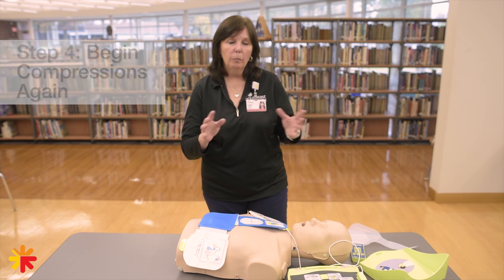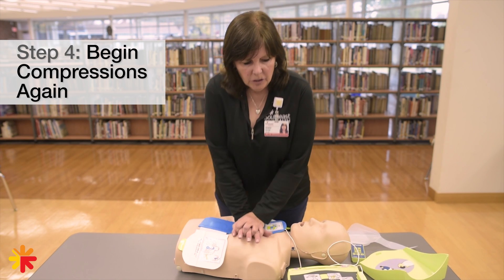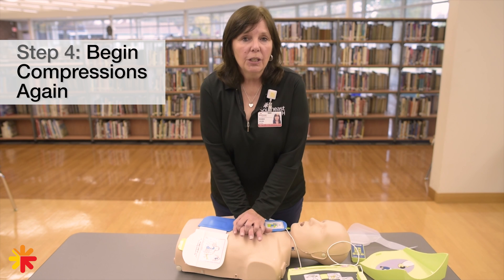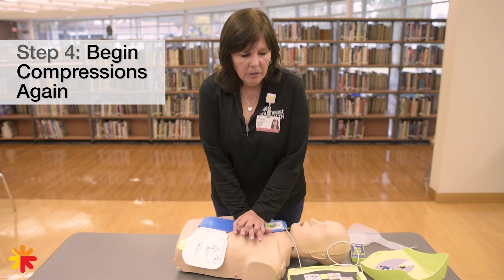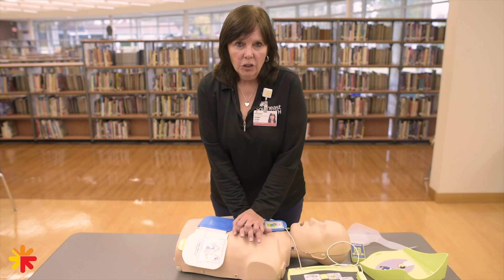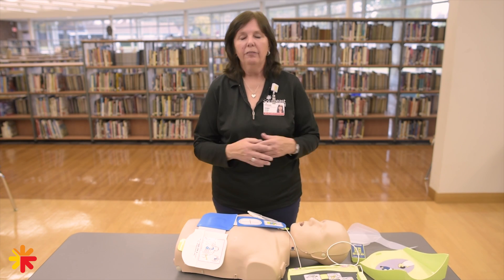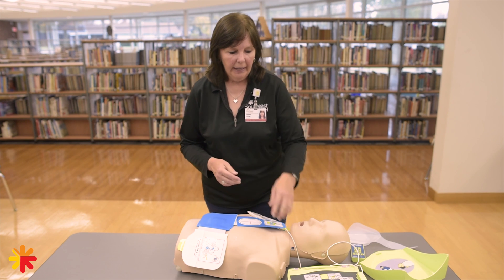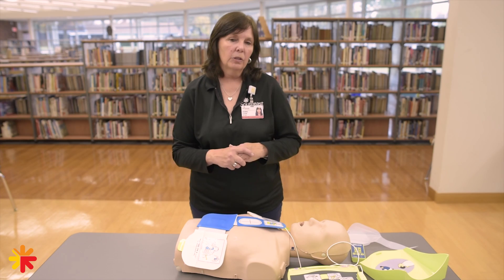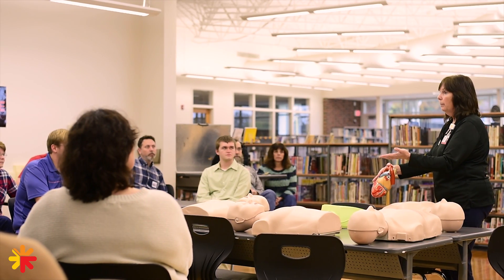That will deliver the shock. If they don't move, breathe, and respond, you get back into compressions and start again. Keep this up for two more minutes, when the machine will again tell you not to touch the patient, analyze the rhythm, and tell you whether or not to shock. Continue doing that while waiting for emergency help to arrive — leave the pads on, don't unplug it, and wait for the emergency folks to arrive and let them take over.